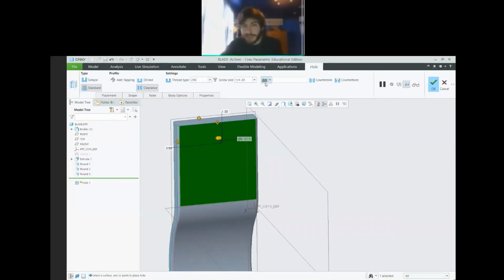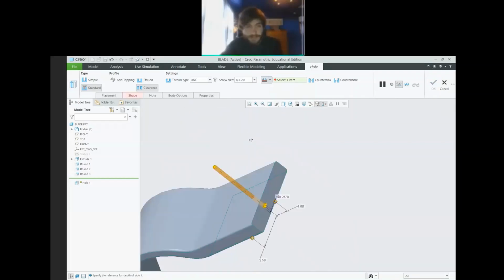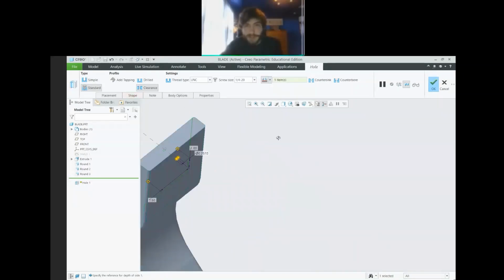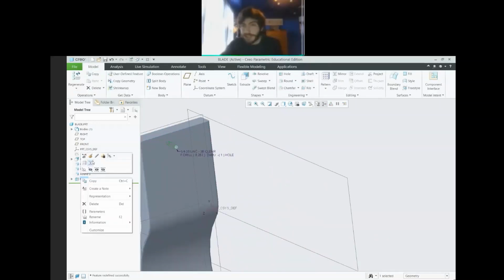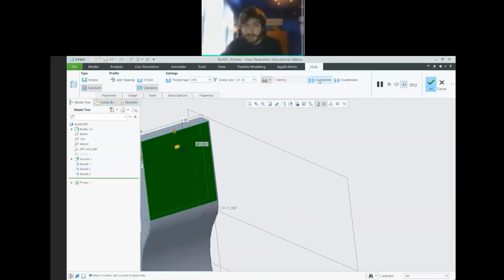So this is our end condition. So this is drill up to next surface, drill through all surfaces, right? We can pick the surface if we want, right? Selecting the back one. Oops. And then this gives us options to add a countersink or counterbore if we wanted to, right? So we could look at that.